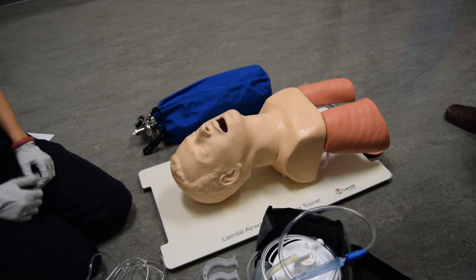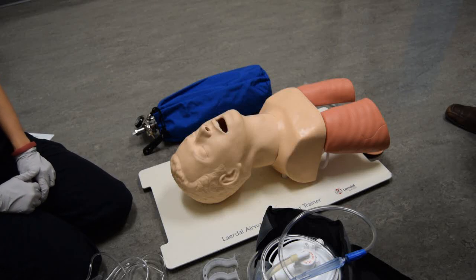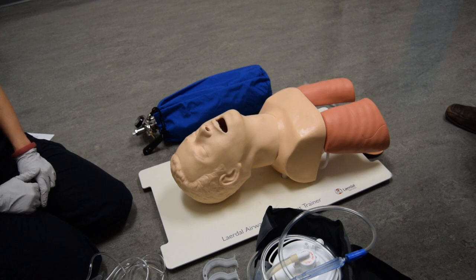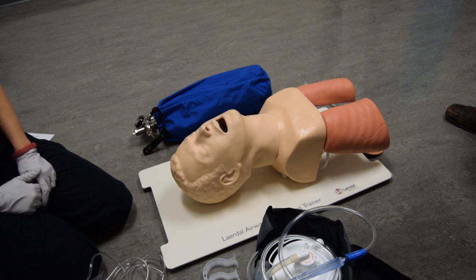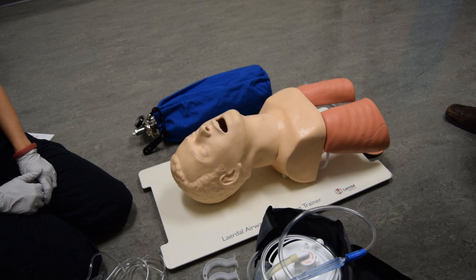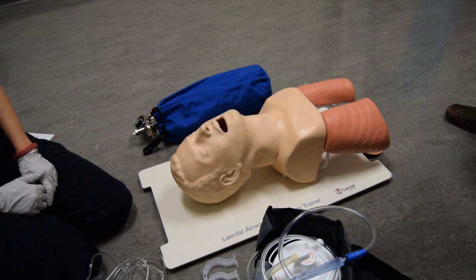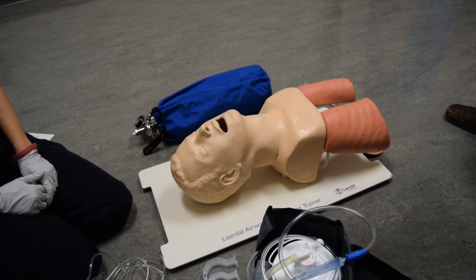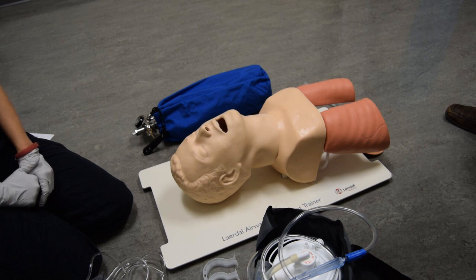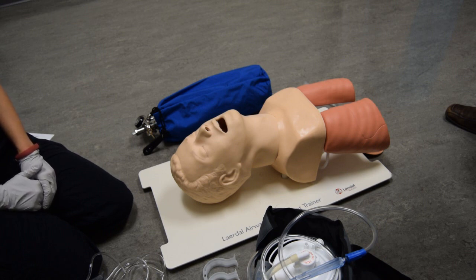Instructions to the practical skills candidate for bag valve mask ventilation of an apneic adult patient. This skill is designed to evaluate your ability to provide an immediate and aggressive ventilatory assistance to an apneic adult patient who has no other associated injuries. This is a non-trauma situation and cervical precautions are not necessary.